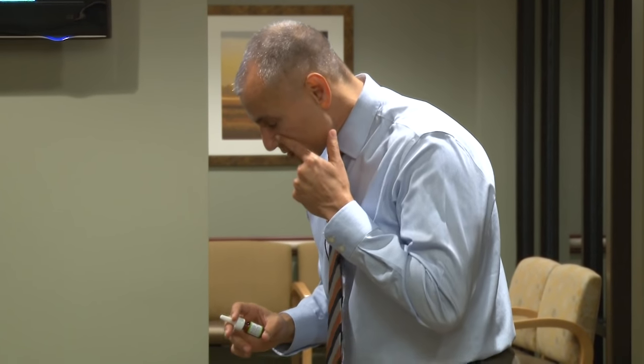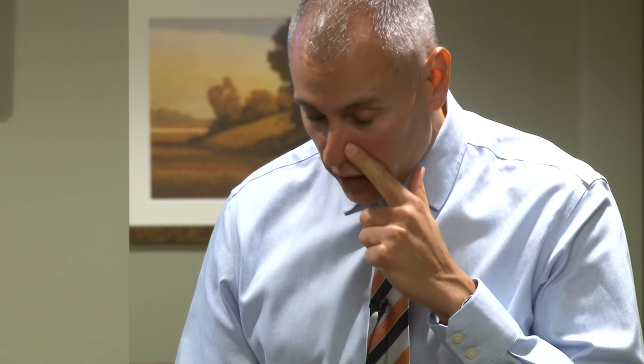The proper way to spray this in is to put your head down like this, and pull your nostril out with one hand. So for my left nostril, I'm going to spray with my right hand, but I'm pulling my nostril out with my left finger.